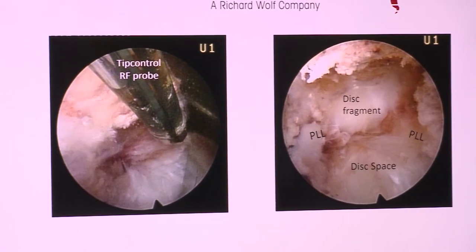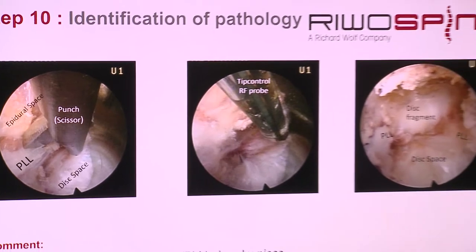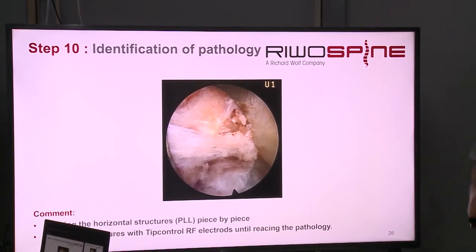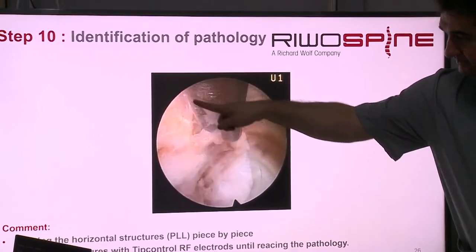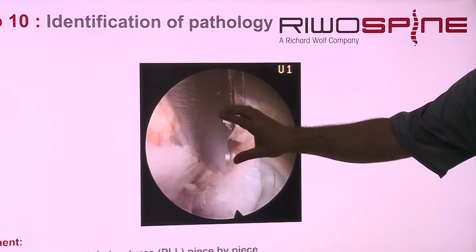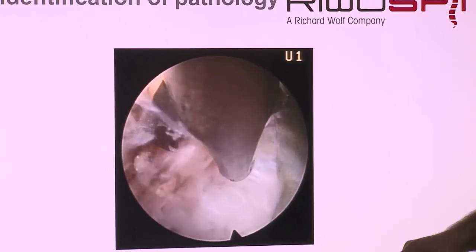Posterior longitudinal ligament. Okay. How do we do it? Let's look at the video. Horizontal fiber, this is the posterior longitudinal ligament. Epidural space, this space. We cut one piece and go inside.